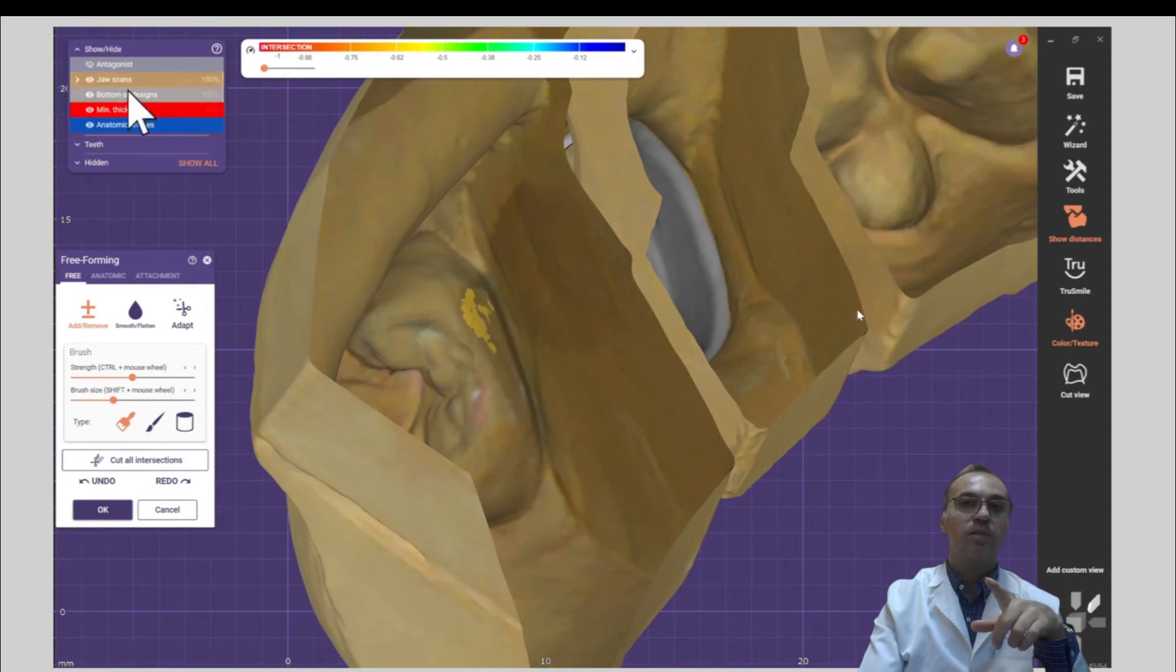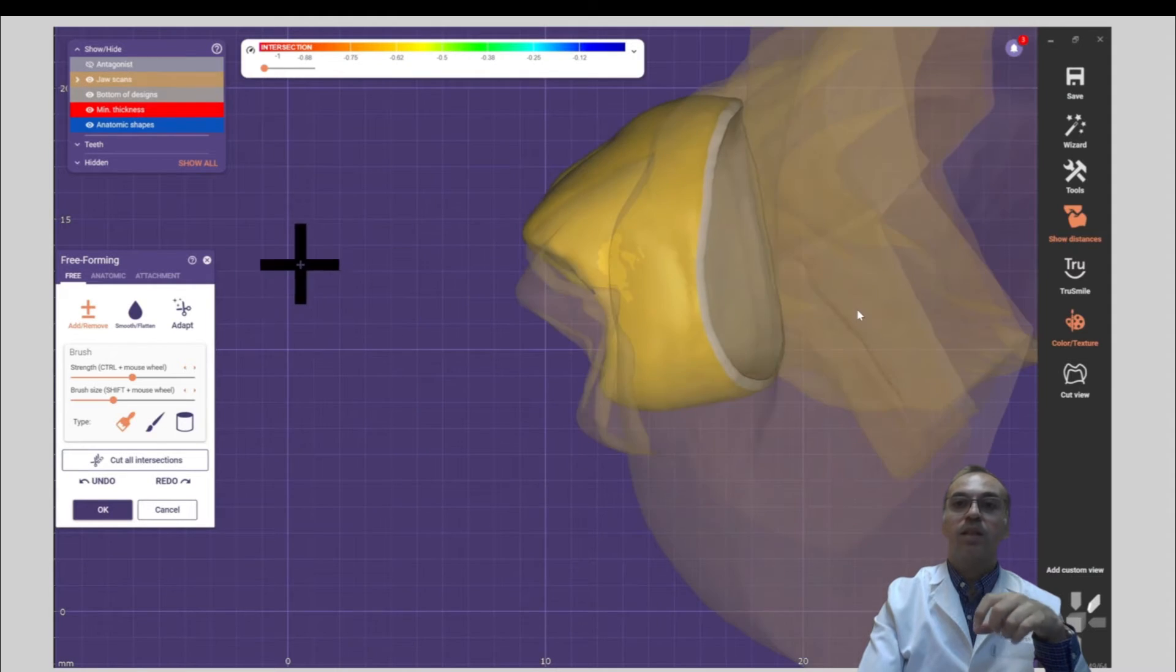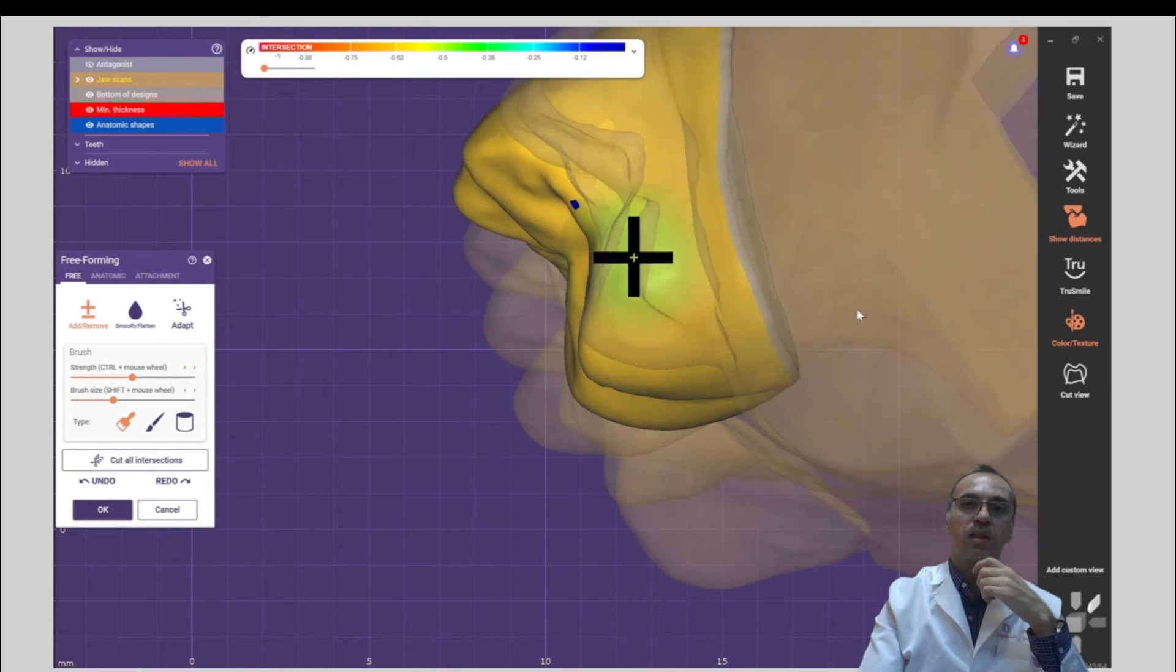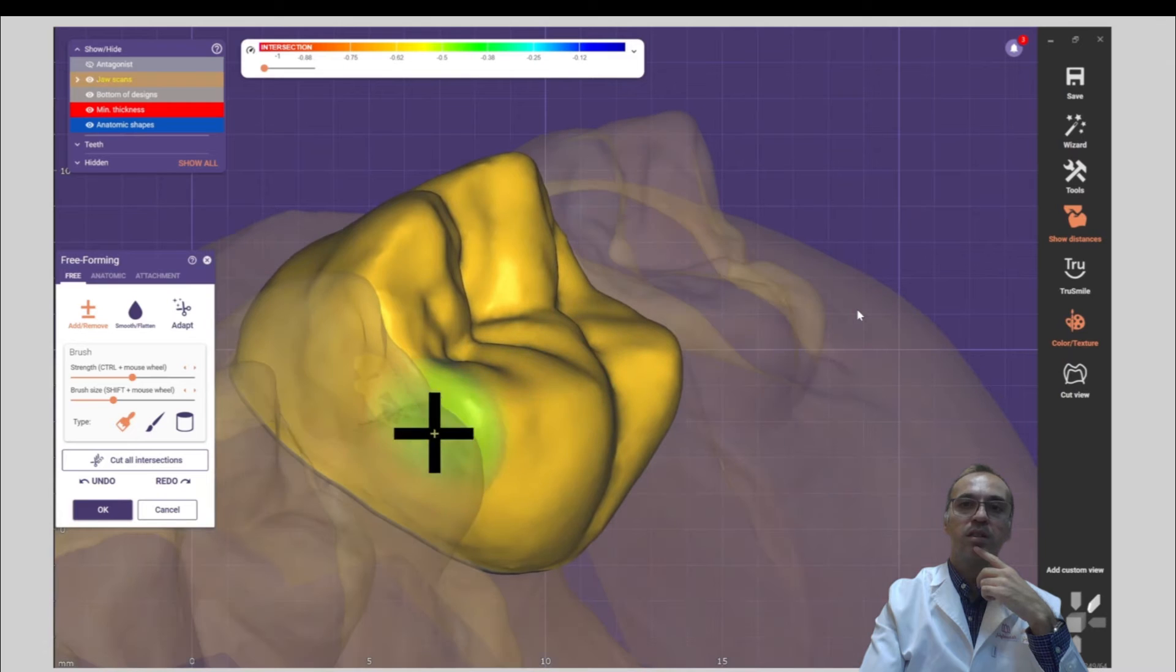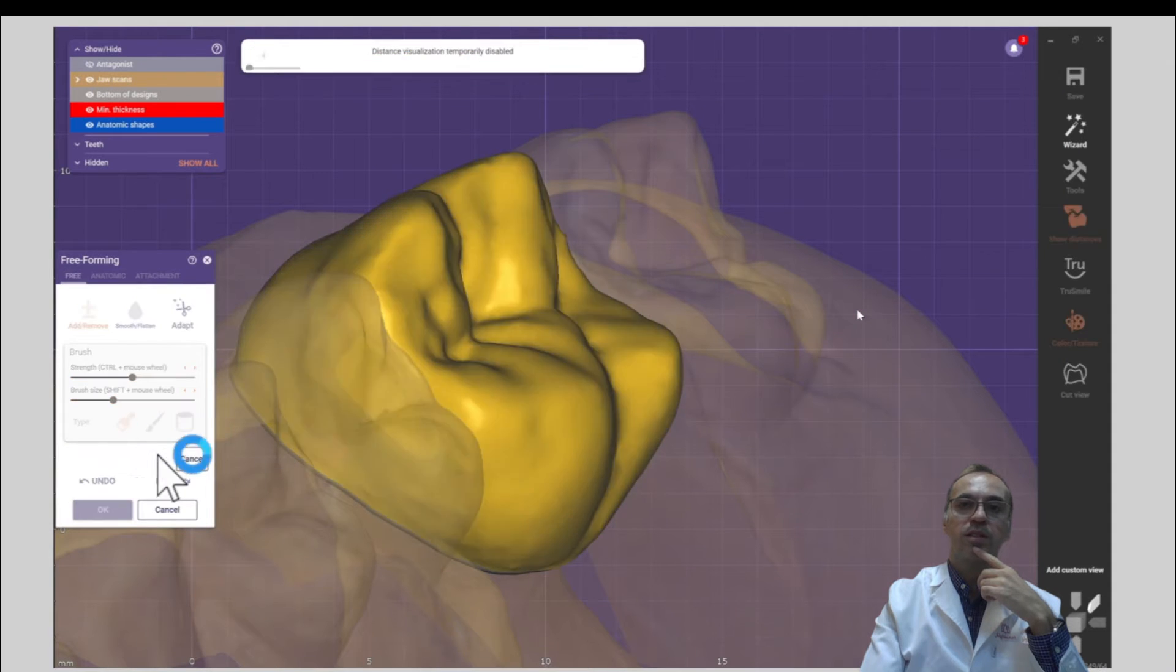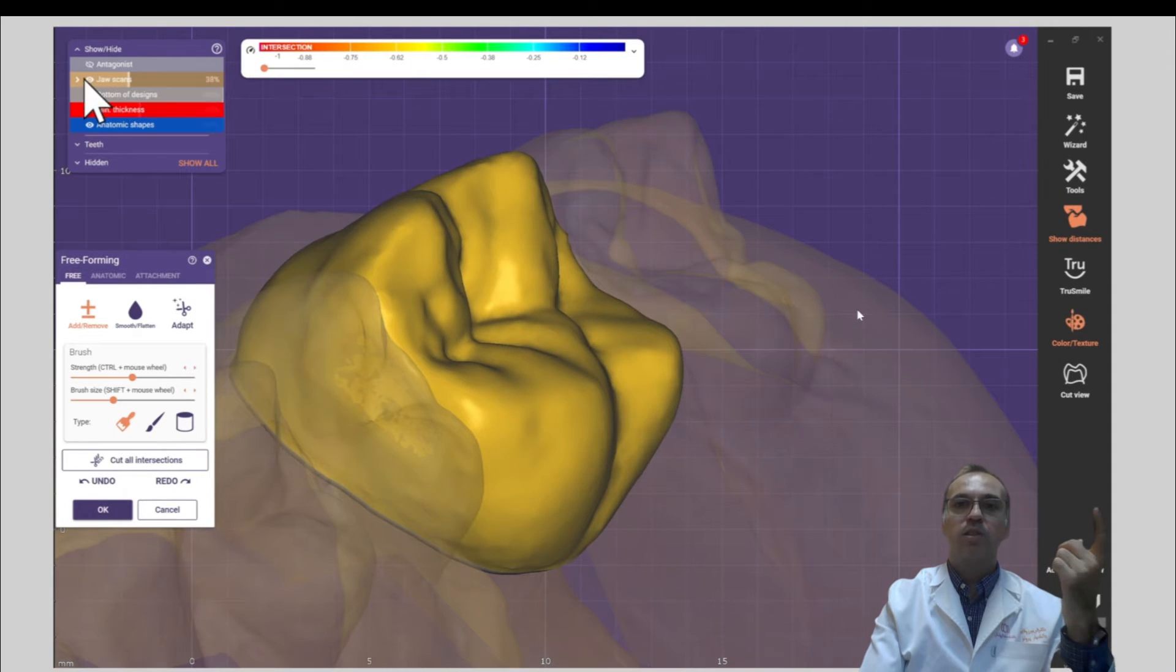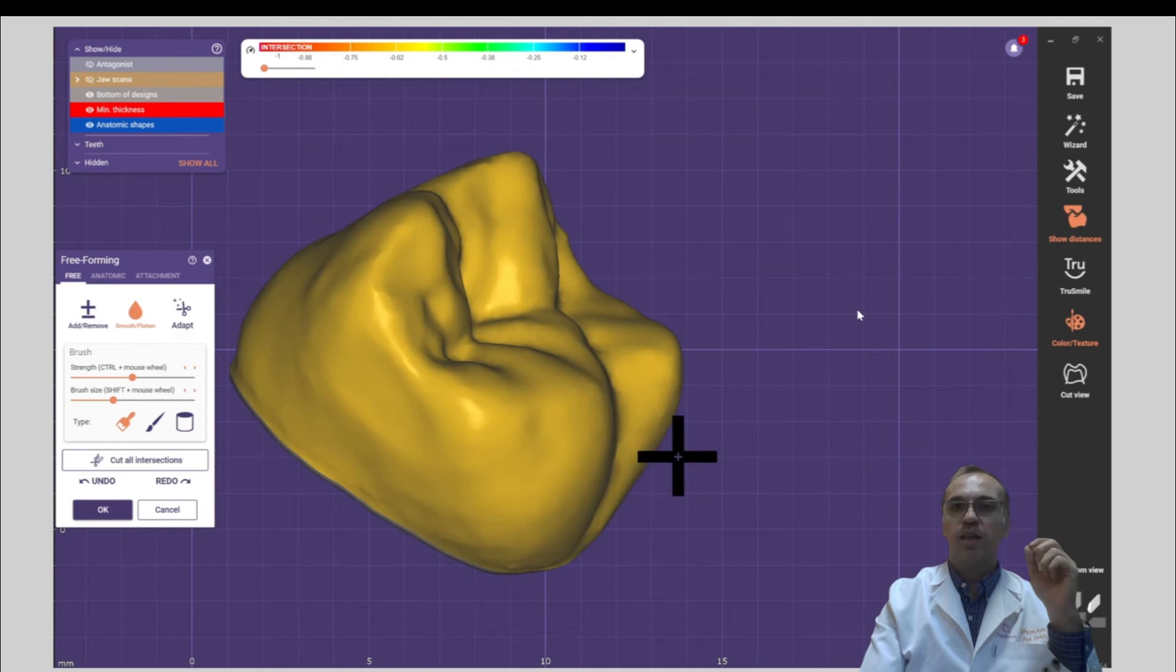Look how beautiful it is. Put contact between the neighboring teeth. And of course, this crown looks like a professional design.